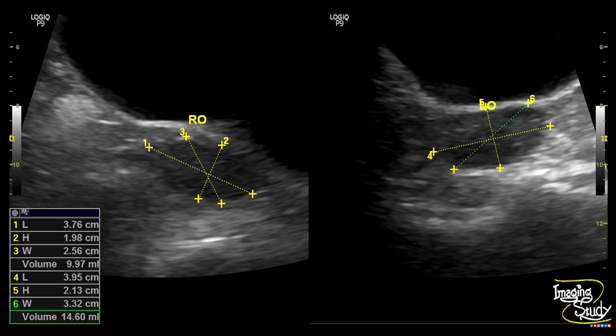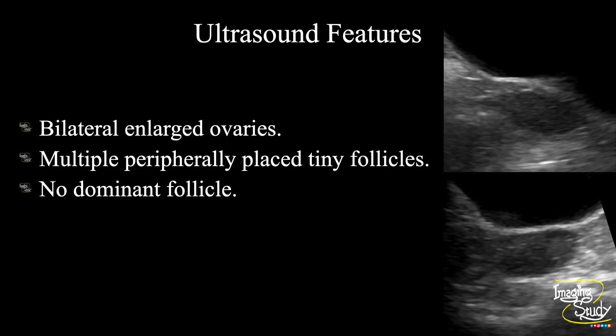These bilateral enlarged ovaries without any dominant follicle, and multiple very tiny peripherally placed follicles, suggest this case as polycystic ovarian disease. In summary, we have seen bilateral enlarged ovaries, multiple peripherally placed tiny follicles, and no dominant follicles. This patient was recommended to go for follicle-stimulating hormone and luteinizing hormone correlation to confirm it as a case of polycystic ovarian disease.